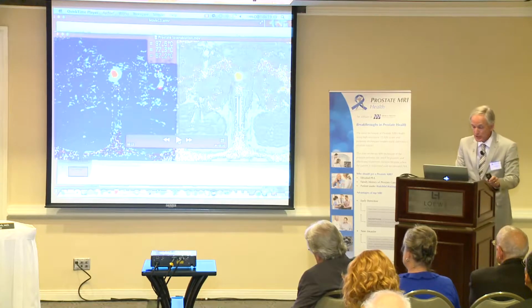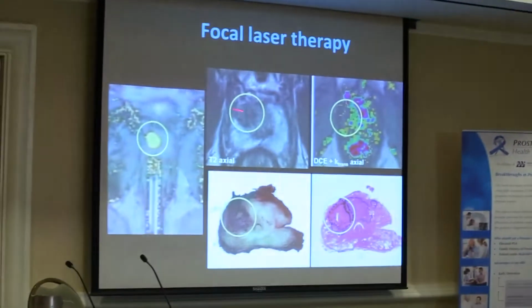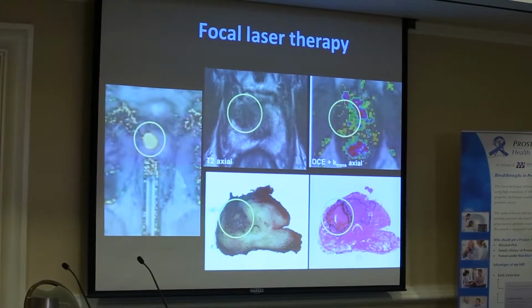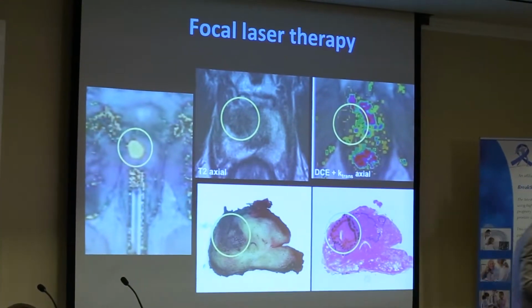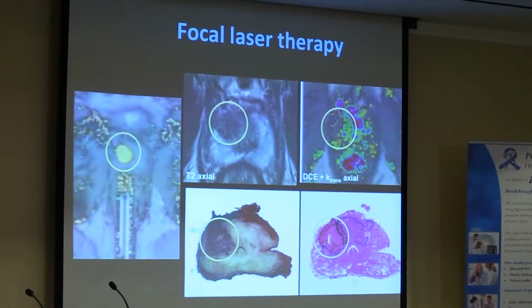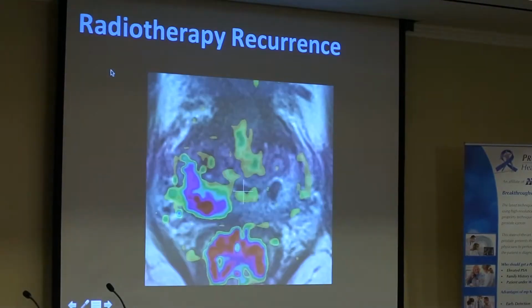Then of course the question is, is this accurate enough? And what about the agreement of the laser versus what we saw on the image afterwards? You see a black hole versus the prostatectomy specimen. You can see that the orange part, the killing zone, exactly matches the tumor, the part of the tumor which was burned away. This potentially can be used in the future as an outpatient procedure. Work in progress, to be continued.